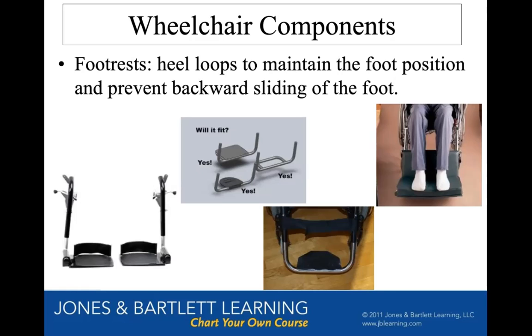And they don't want to remove their leg rest, and they need to keep their legs in place at all times, so they usually keep their leg rest on. Usually more independent people in more independent types of chairs will have solid leg rests that don't come off. But in most types of chairs, they can swing away and come off the chair completely.